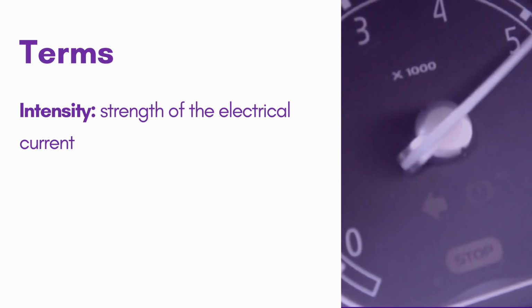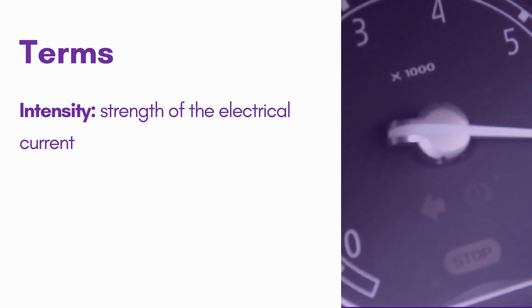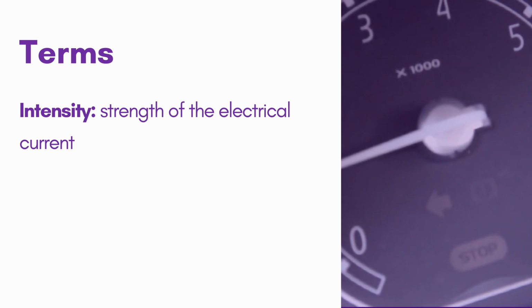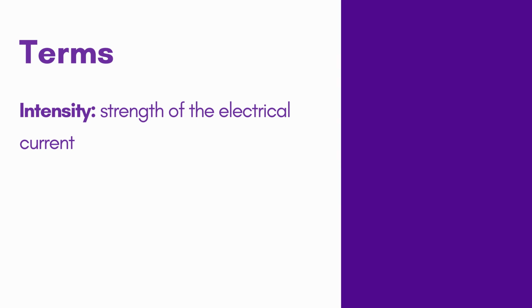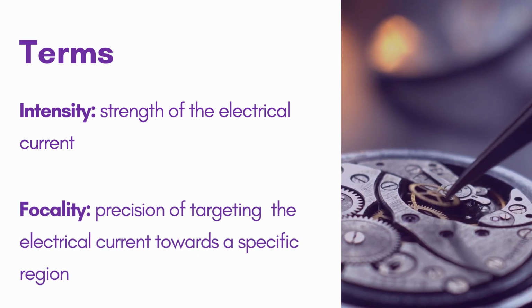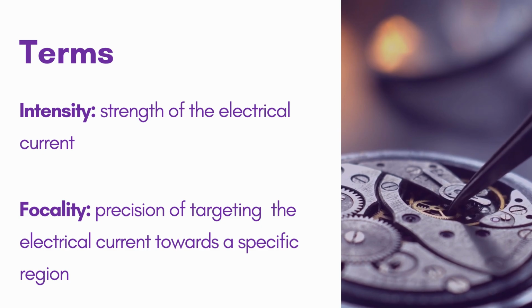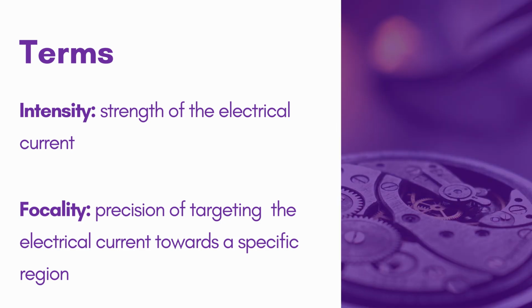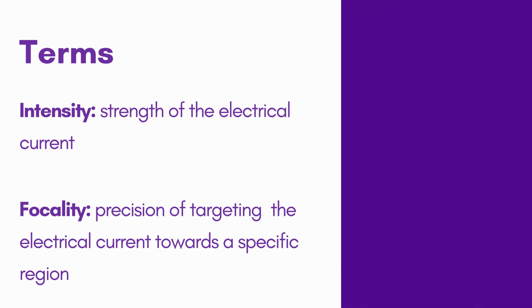Intensity refers to the strength of the electrical current delivered to the brain during TES. The intensity of stimulation can be adjusted based on the specific treatment goals and individual patient factors. Focality refers to the degree of precision with which the electrical current is targeted towards a specific region of the brain. Higher focality means that the stimulation is more precisely targeted, resulting in better treatment outcomes and reduced side effects.